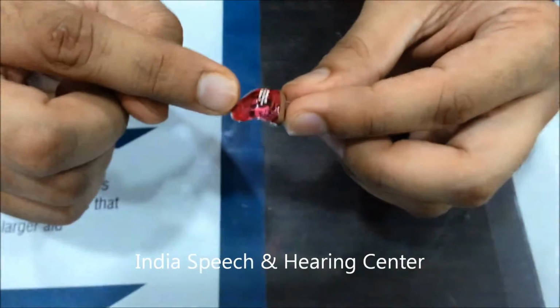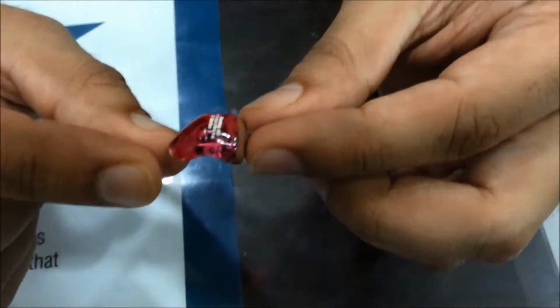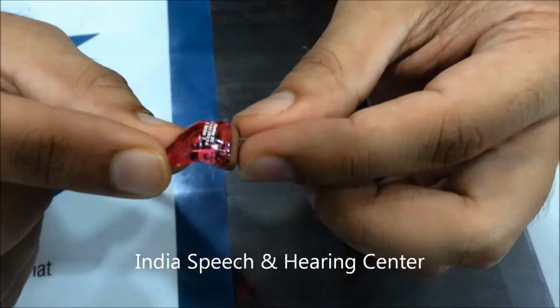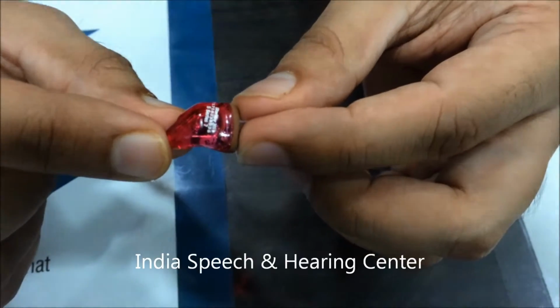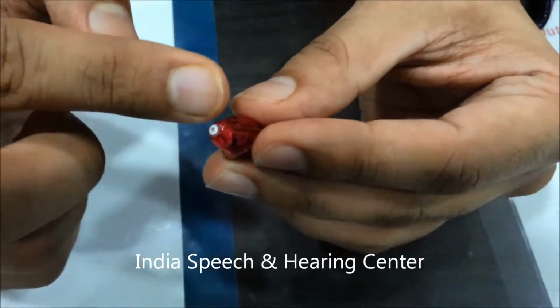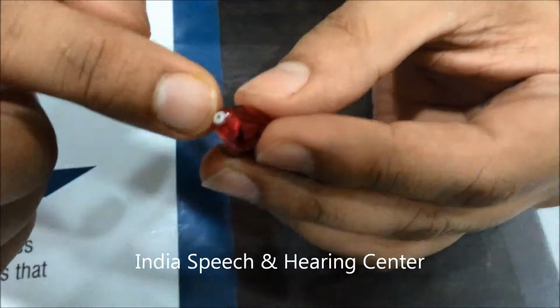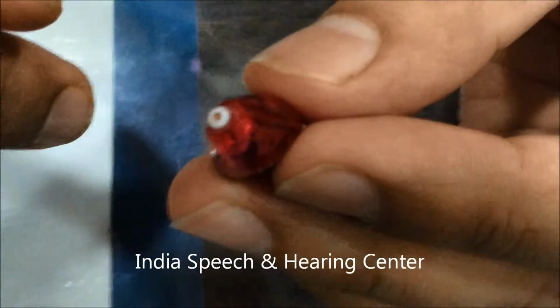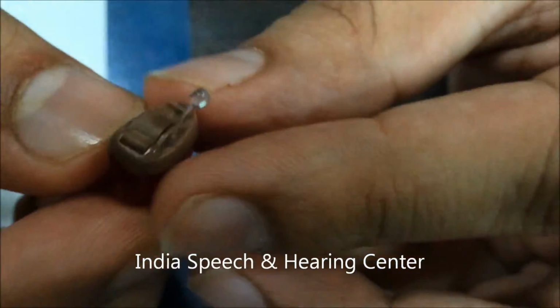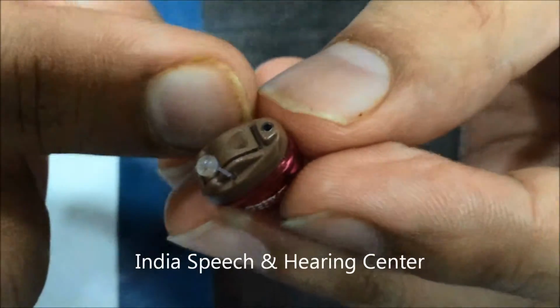Within the CIC, it houses a small microphone, receiver, a microchip, and the amplifier. There are two ends to this hearing aid. This end, which holds the white filter or the wax guard, goes inside the ear, and this end, which you see is brown in color, is the faceplate. It holds the battery.